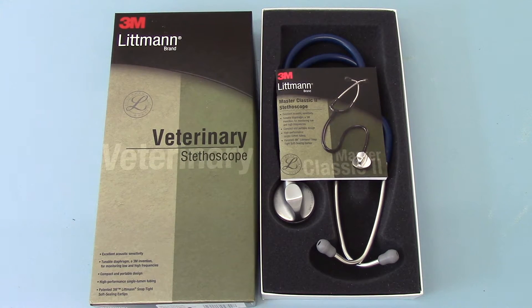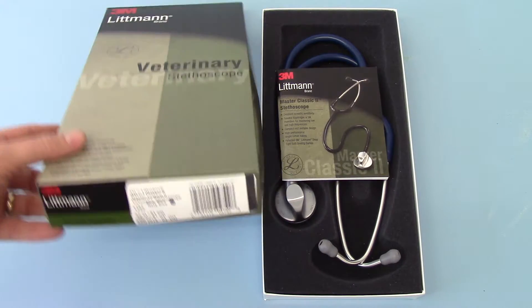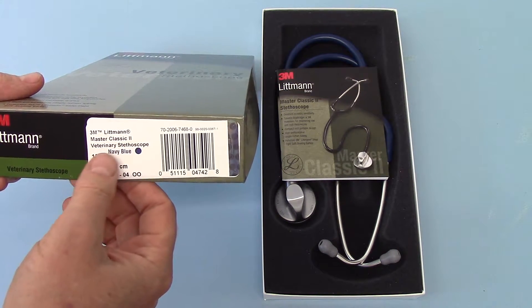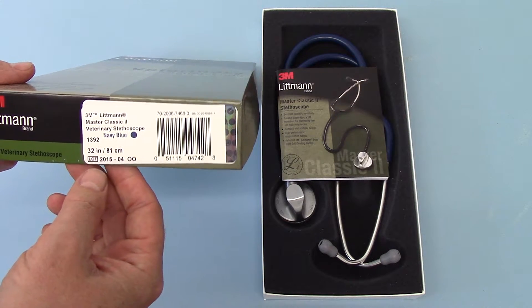Welcome to this product demonstration of the 3M Littmann Veterinary Stethoscope. This one we are showing you here is the navy blue tube model. The catalogue reference for this is the Littmann Master Classic II Veterinary Stethoscope navy blue, catalogue code 1392.